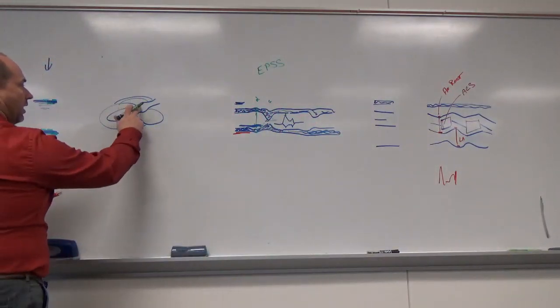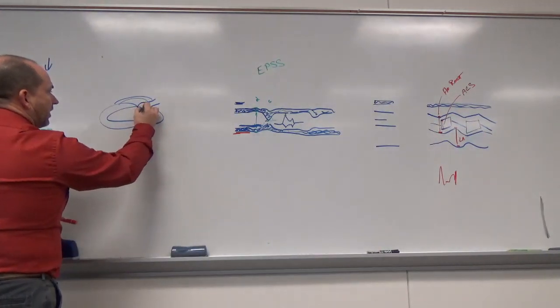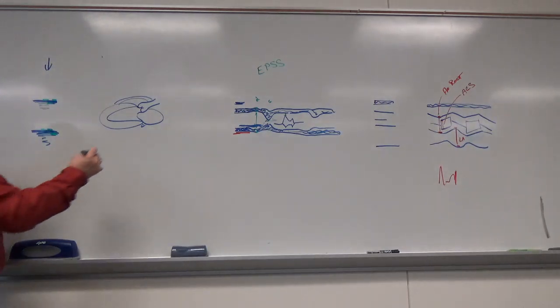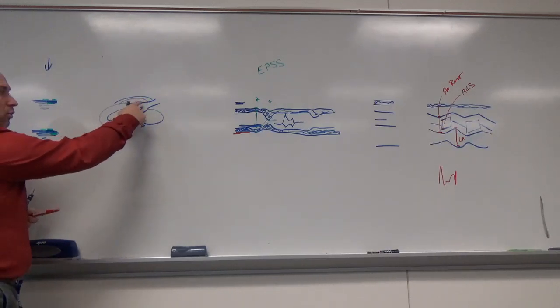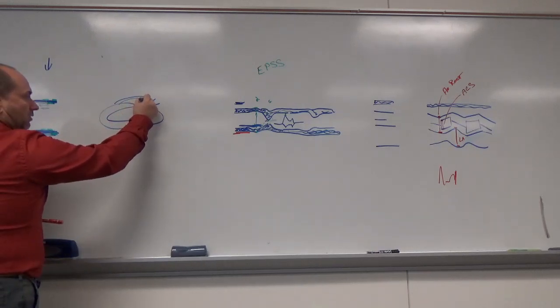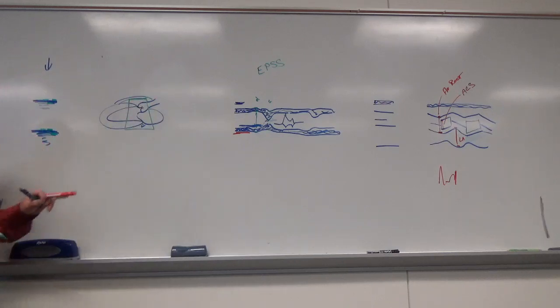So what's important on the valves, let's draw the valves in. We're going to look at the aortic valve and mitral valve. They're right close together. We're going to zoom in first. Okay, so we've got our overall perspective. I want to see the walls of the valves because I need to see if there's any holes where there shouldn't be. And I also need to see the valves themselves to see if there's flow getting through it or if it's leaking back. So my color box, or my region of interest box, the ROI, is going to look something like that.